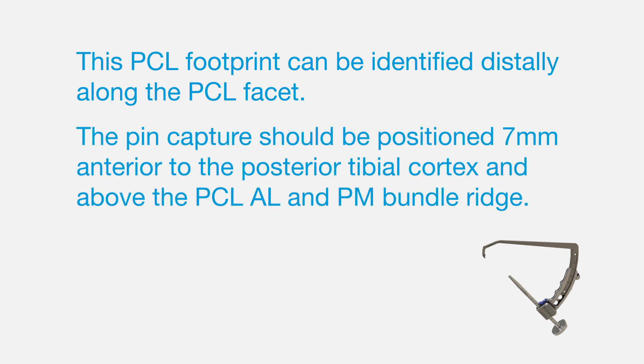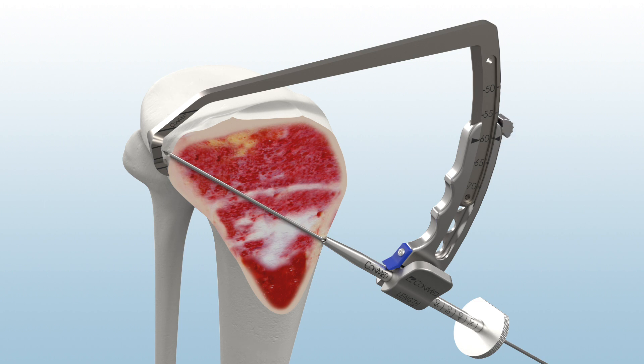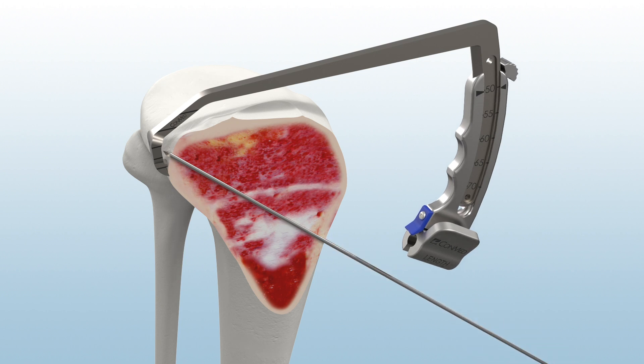The pin capture should be positioned 7 mm anterior to the posterior tibial cortex and above the PCL-AL and PM bundle ridge. Under direct visualization, advance the 2.4 mm guide pin through the anteromedial tibia until the pin contacts the pin capture point. Then, remove the guide sleeve but maintain the position of the guide arm and body to protect vascular structures while reaming.